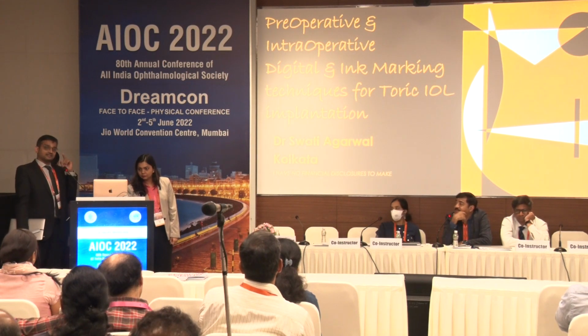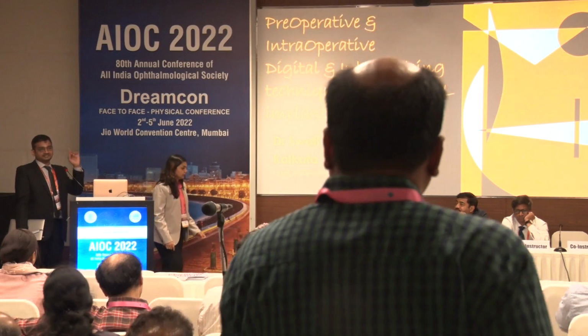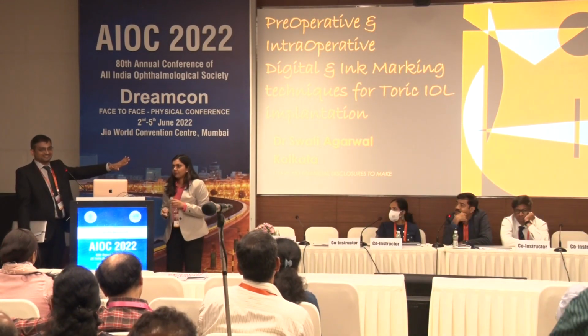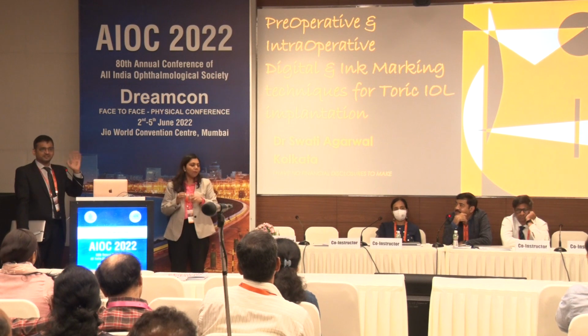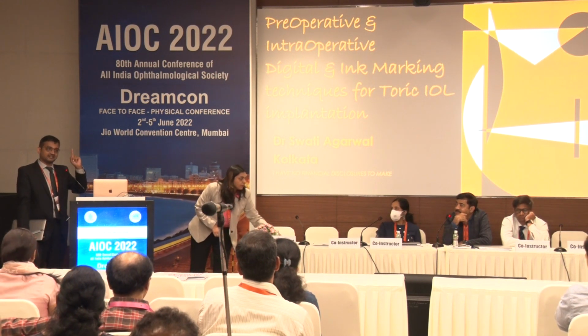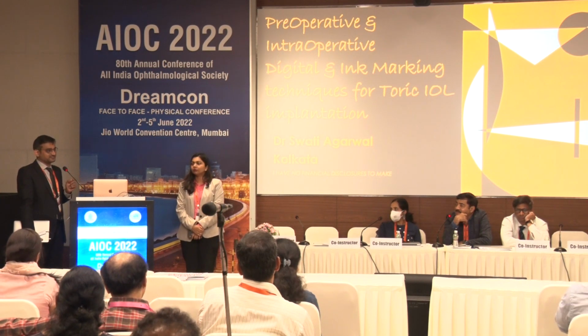Absolutely, that's what I would say. You will hit 6x6 and 6x9 in 75 to 80% of patients without too much effort, just by the clinical evaluation, refractive astigmatism, and the matching of the axes. Matching is very important. One point you can take: don't rely on a single reading, because that reading can be inconsistent, especially if it is not matching with the refractive cylinder. Yes, sir.